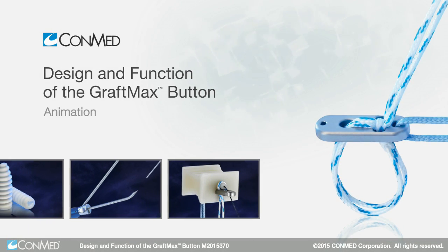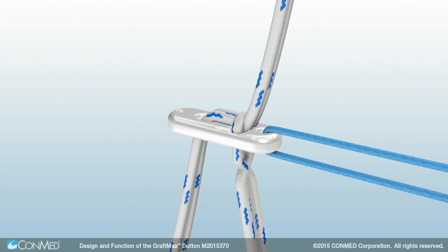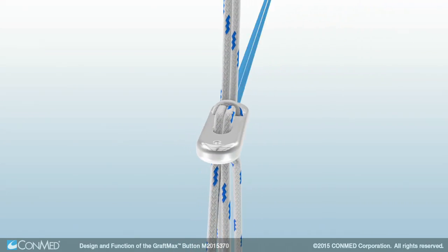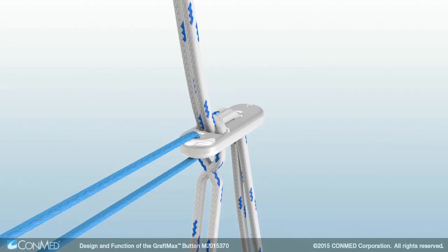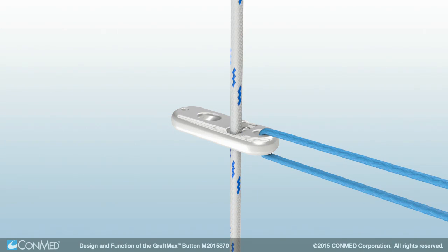The GraftMax Adjustable Loop Button combines the clinical ease of use of adjustable loop designs with the graft fixation strength of a fixed loop button. Its unique dual fixation design incorporates friction and mechanical locking, which has demonstrated a reduction of displacement by 70% compared to other adjustable loop designs. A titanium button is combined with No. 5 Hi-Fi Suture.